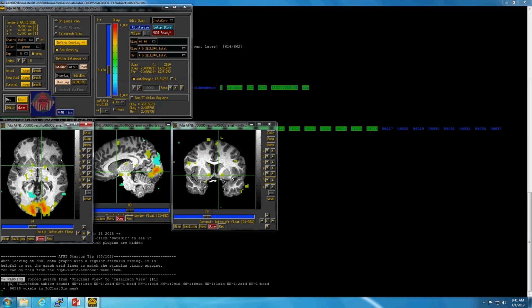So what we're going to do is go through all of this and get the variability of each subject in response to those 3 conditions that we looked at. Then each subject will have 3 numbers from the MRI, and we'll take those numbers. First of all, we expect that testosterone is going to modulate those numbers.